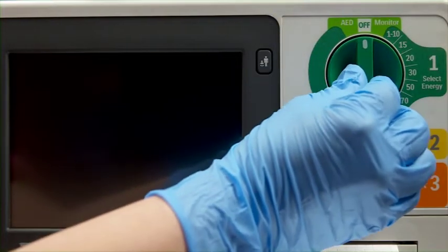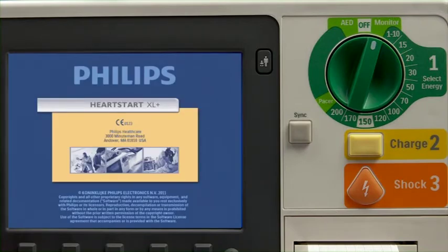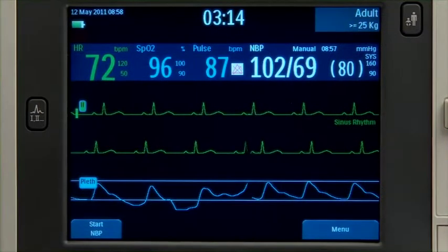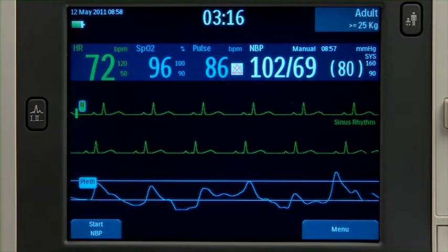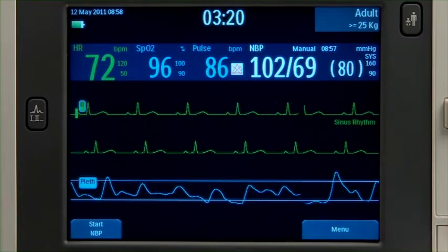The therapy knob is the on-off switch. Just turn it to the desired mode of operation. The information on the color display is customized for each mode, and its layout may vary depending on your device's installed options.